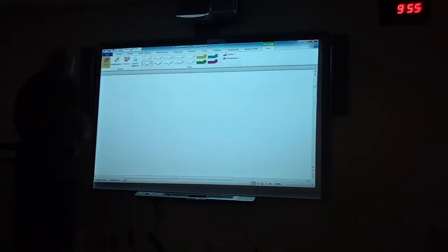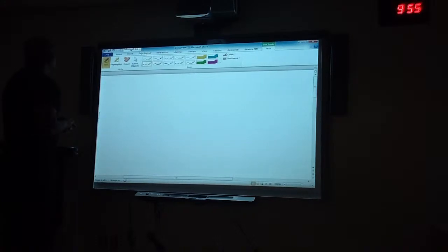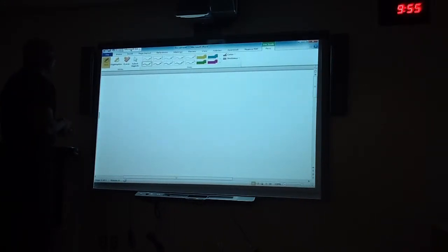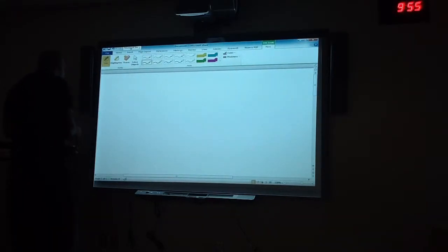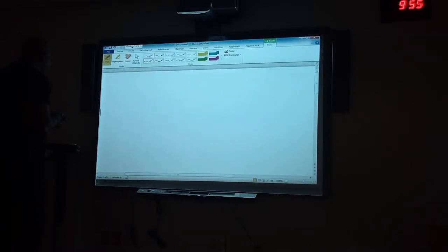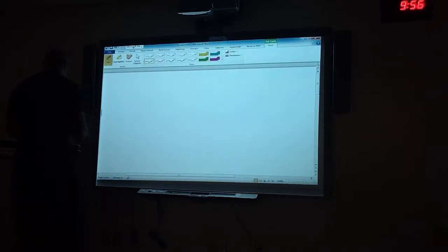Good evening, class. Today I will be covering a topic in Chapter 5, that's gases and pressure. So what I'll be doing is demonstrating our ability to measure blood pressure using gas and pressure. So basically the first question I want to put in your mind as I go through the demonstration is, how is gas and pressure used to measure blood pressure?